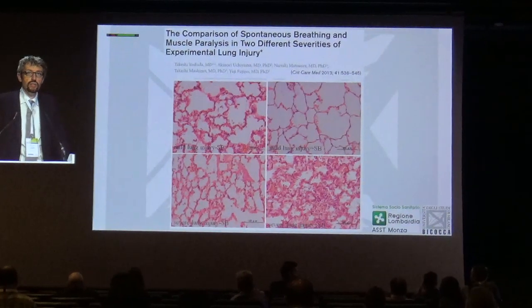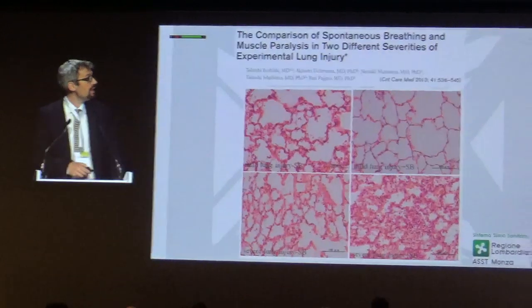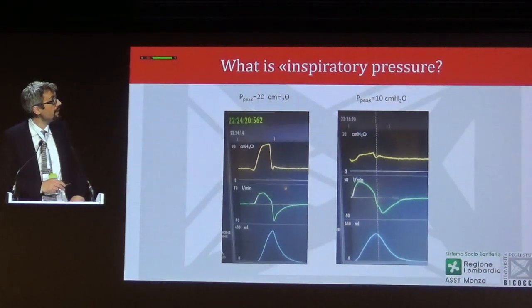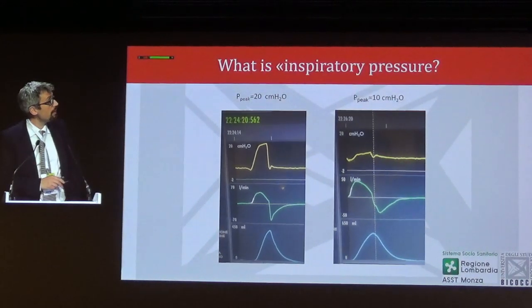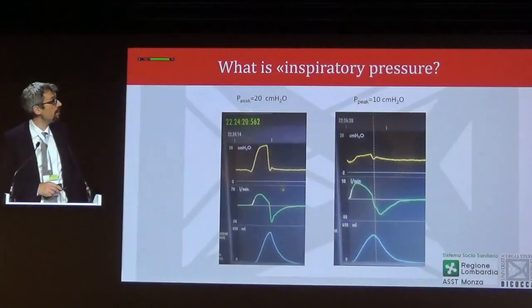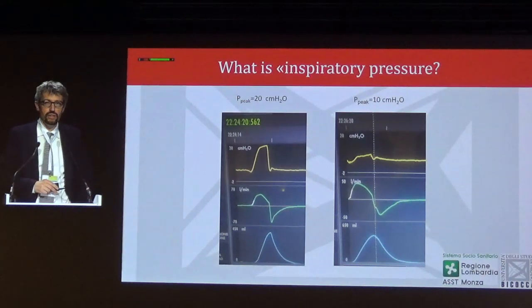that the patient is imposing on the respiratory system. And when we consider a patient who is spontaneously breathing, it's important that we keep in mind, as we are probably aware, that the inspiratory pressure is not just the pressure we see on the ventilator screen.